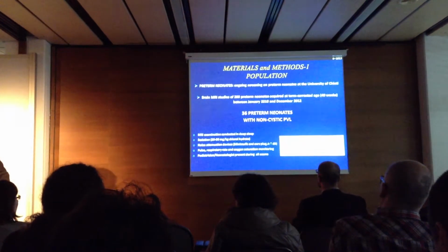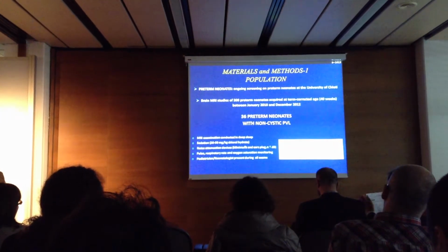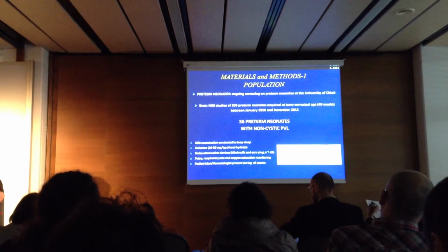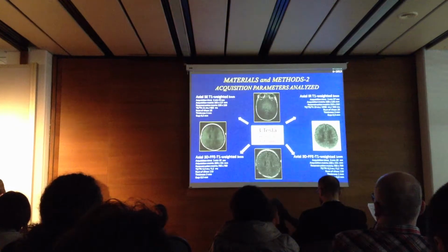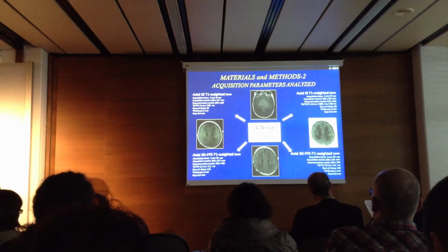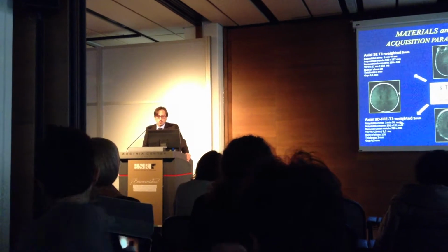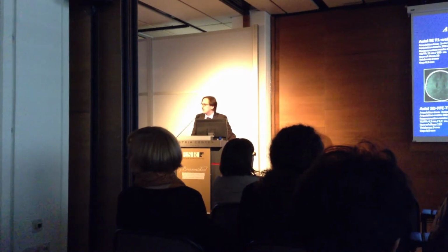The presence of periventricular leukomalacia was retrospectively analyzed in 200 preterm neonates studied at term corrected age between 2010 and 2012. Finally, 36 preterm neonates were enrolled in the study. All MRI examinations were performed under medical control, and exposure to the magnetic field and noise fell within the safety limits. In each patient, the number of T1 hyperintense punctate lesions was assessed in 4 different axial T1 weighted sequences: conventional spin echo, an inversion recovery, an axial reformatted 3-dimensional fast field echo sequence, all with 3 mm of slice thickness, and the last one was an axial reformatted 3D fast field echo with 1 mm of slice thickness.